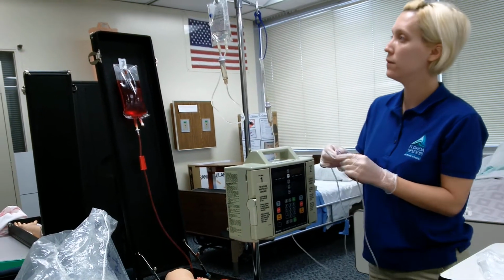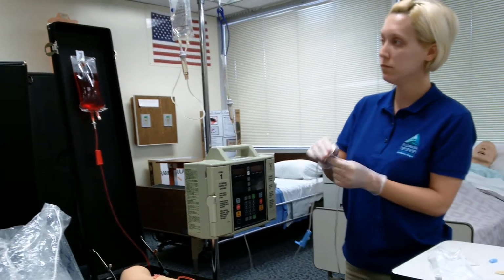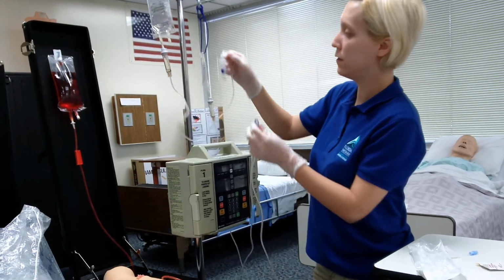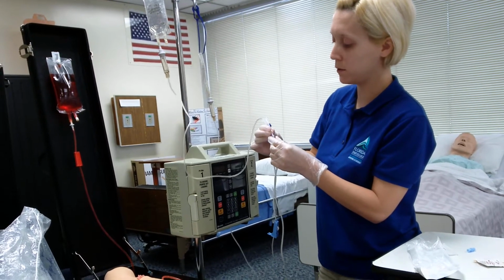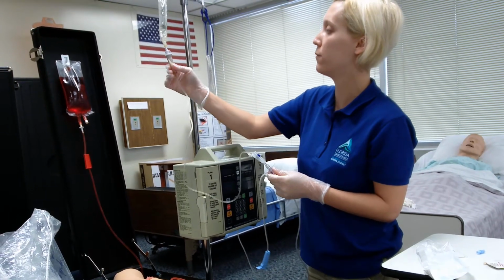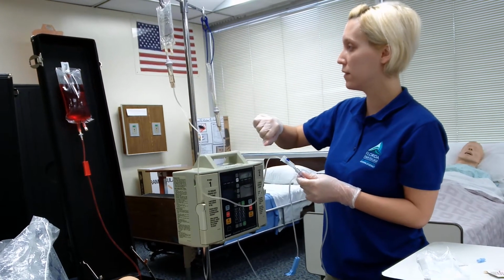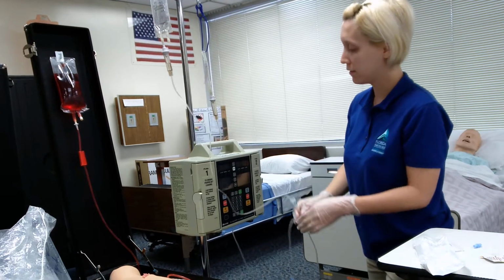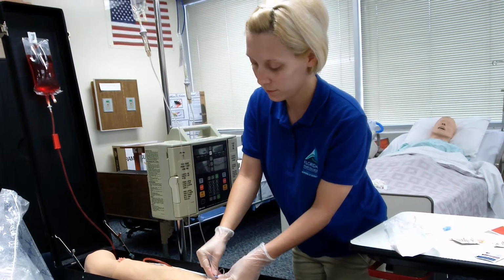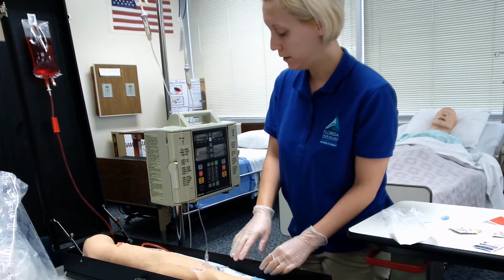I'm going to clean my ports with alcohol. I'm going to attach this and unclamp. I'm going to fill this halfway. I'm going to ensure that it's running correctly, 17 drops per minute. Okay, that looks good. I'm going to unclamp here. I'm going to check my site again for any infiltration. How are you doing? Okay.